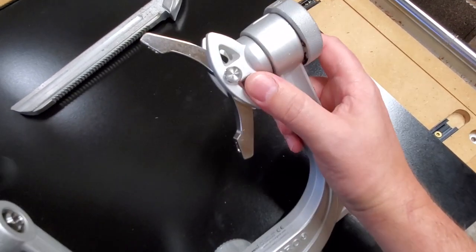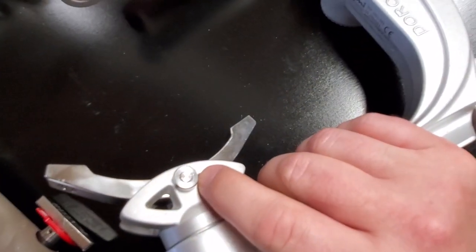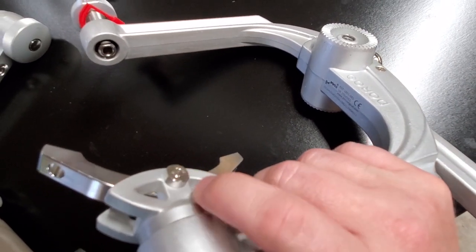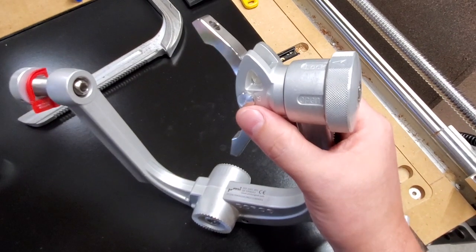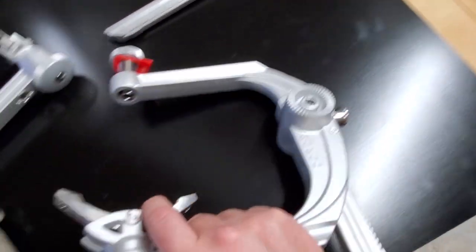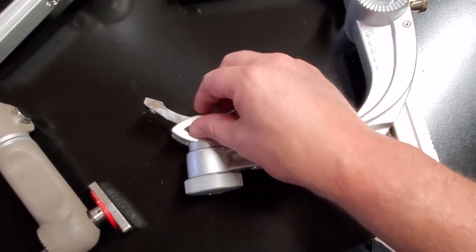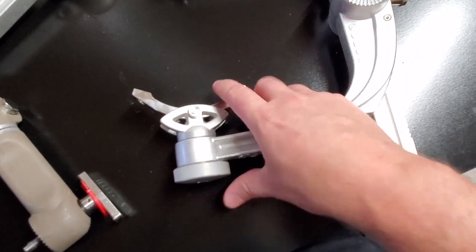There's other pieces that you should take apart as well, especially if you're going to clean this up and adjust it. Right here, you've got one piece of the fastener, and over here is the nut. They have slight little flats on them. You can see one of the flats right there. So what I do is I put vice grips on one side very, very finely so you're not creating permanent indents in the fastener. And then you put a set of vice grips on this side and you just crack them loose, and then you can take them off.